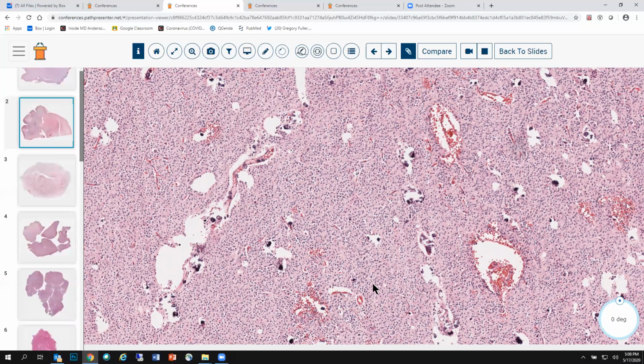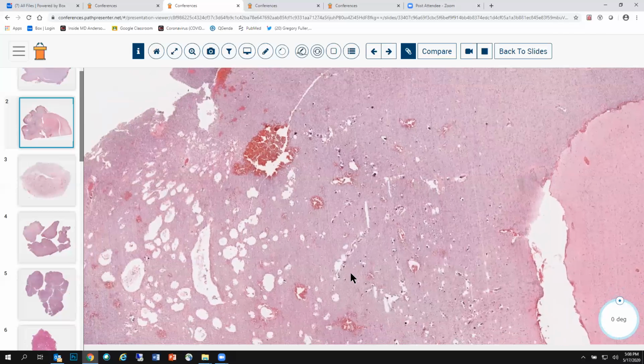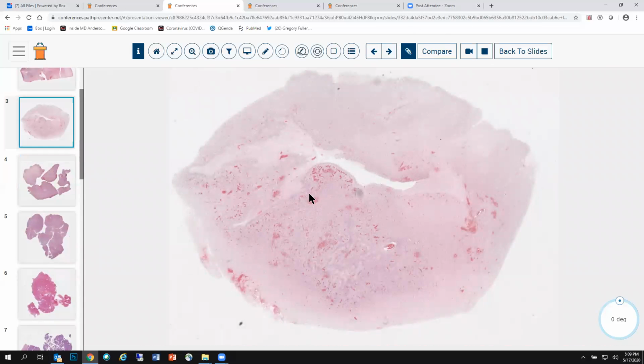In order to call this tumor oligodendroglioma, IDH mutant, 1p/19q co-deleted, which is the most precise WHO 2016 diagnosis, we have to evaluate both the IDH1 and IDH2 mutation status, and we do that initially with simple immunohistochemistry for R132H mutant protein, and for co-deletion of 1p and 19q. And there are a variety of methodologies for doing that. FISH is the most common, even though least specific. All right, let's move on to case number 3.